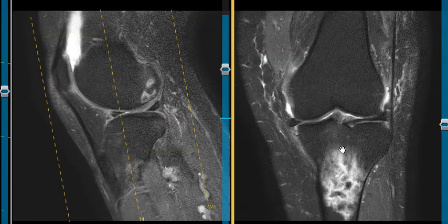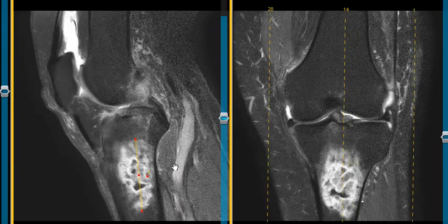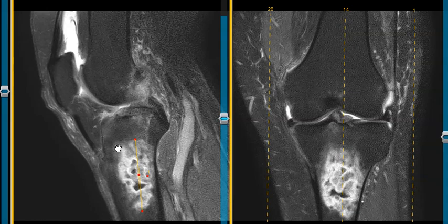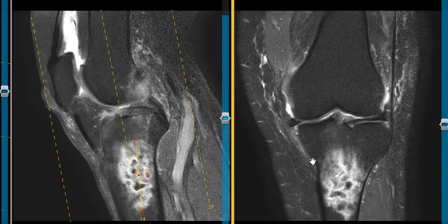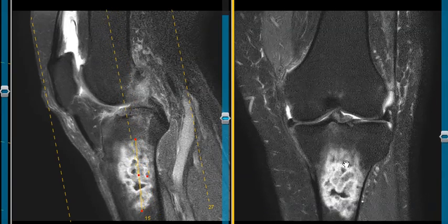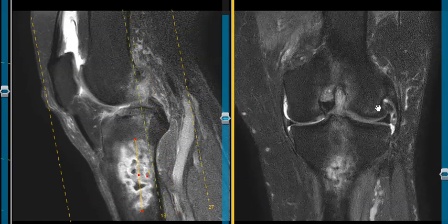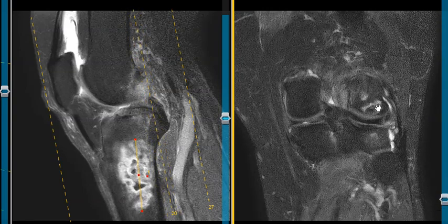I believe this is going to end up being a really prominent acute bone infarction or avascular necrosis. These can be incited by prior trauma, and can be related to sickle cell disease, radiation therapy, renal transplants, pancreatitis, gout, or steroid use. So again, we believe this is going to be an acute bone infarction in the tibia, and there's an old bone infarction here in the lateral femoral condyle.